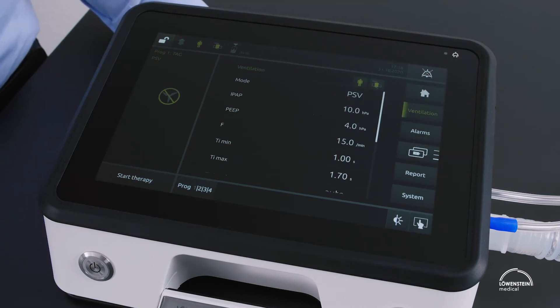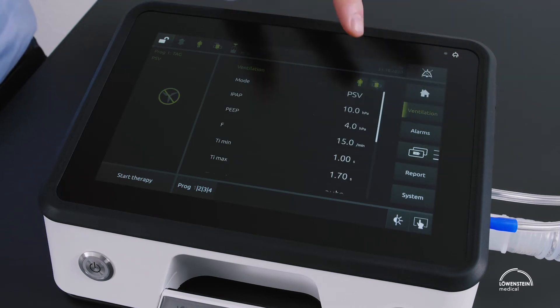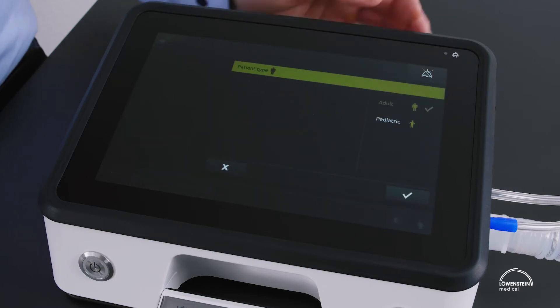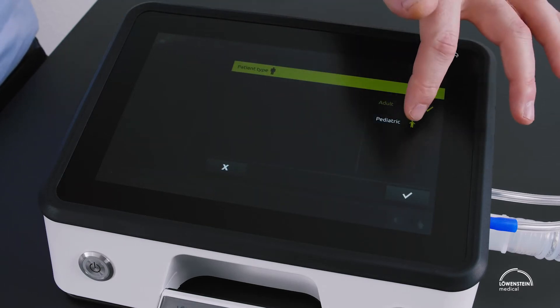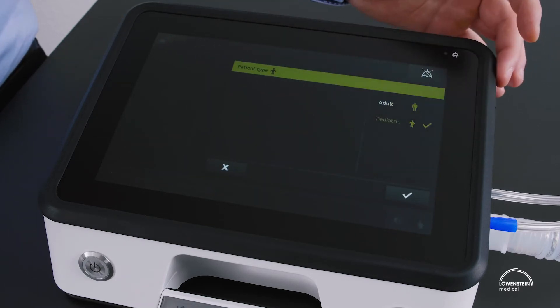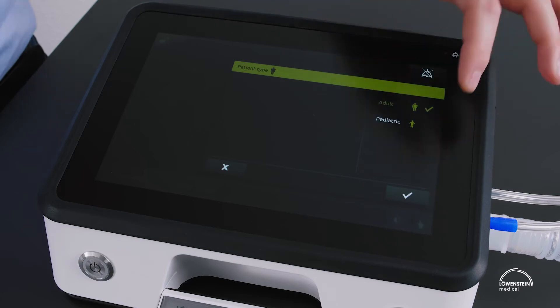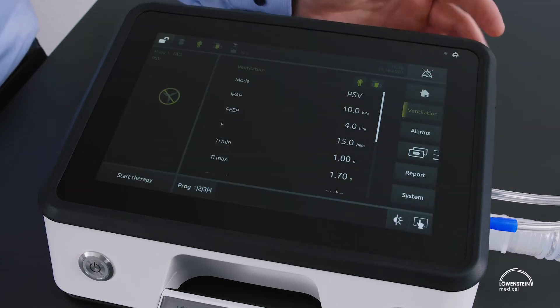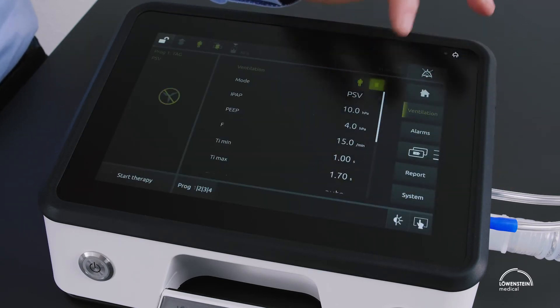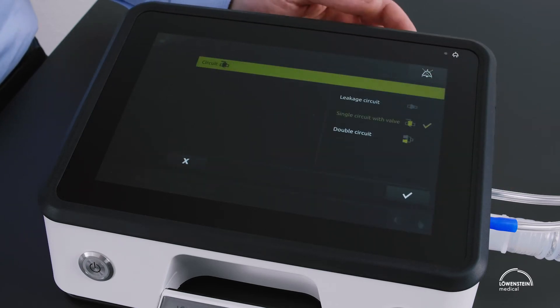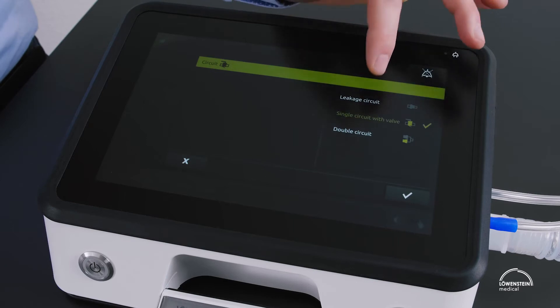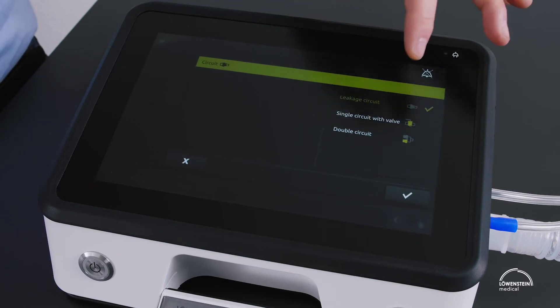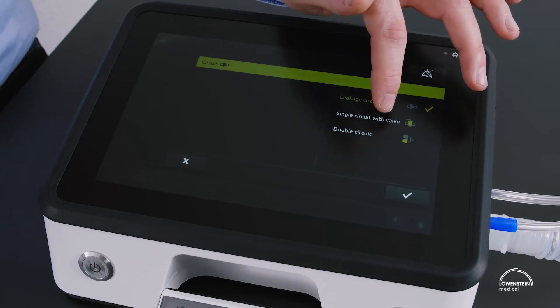We select our patient type — whether we would like to ventilate an adult patient or a pediatric patient. Next is the circuit selection, where we choose whether to use a leakage circuit, a single circuit with valve, or a double circuit.